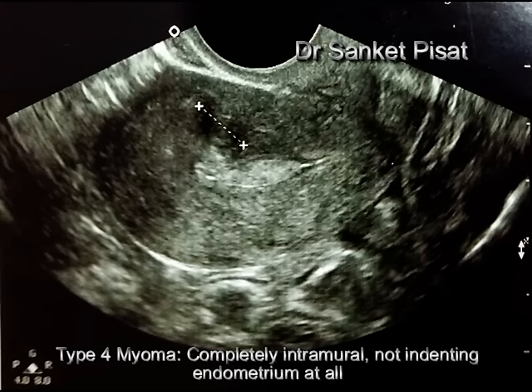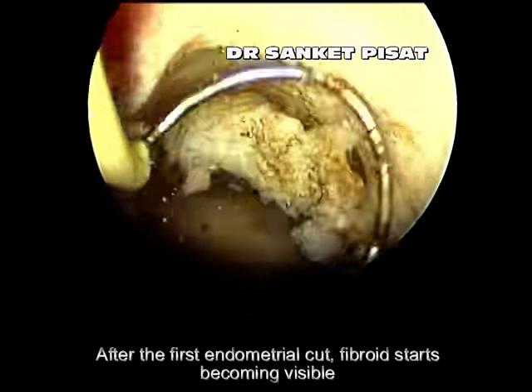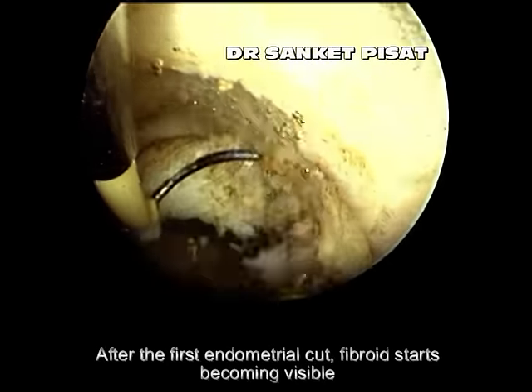This is a patient with a type 4 myoma, completely intramural and not indenting the endometrium. A good mapping of the fibroid by ultrasound clearly shows the depth of the fibroid beyond the endometrium, as well as the safety margin up to serosa.